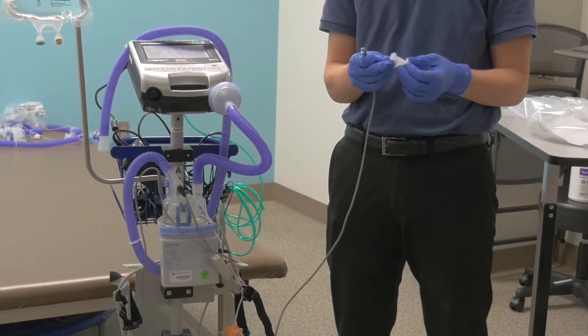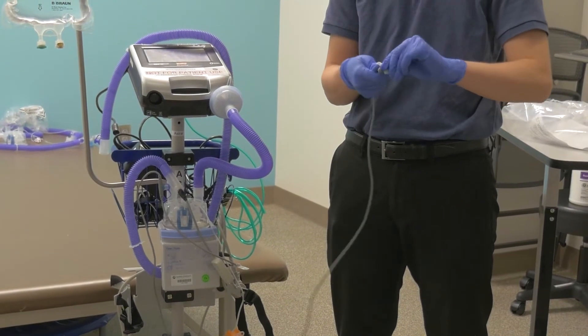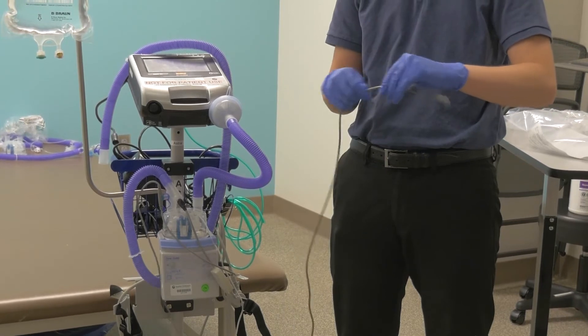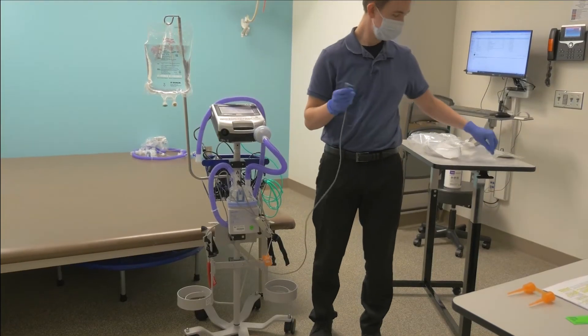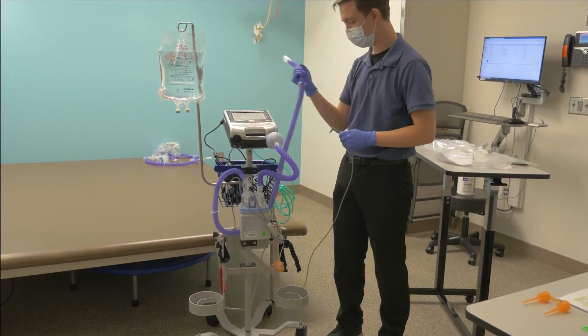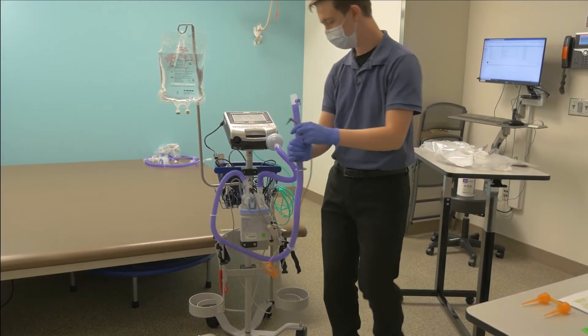Clean the second temperature probe as well with an alcohol wipe. This one is at the end of the long cable. Place the probe into the opening at the other end of the longer ventilator circuit tube. You may have to twist the probe as you push it into the opening in order to get it completely inside.